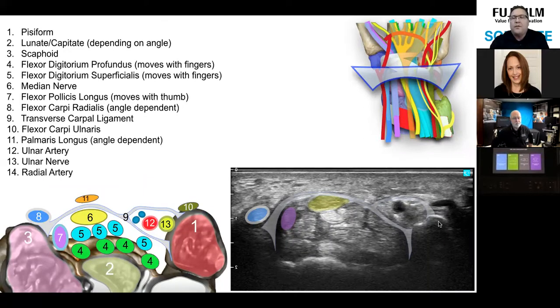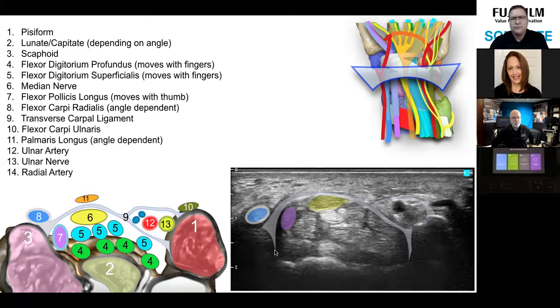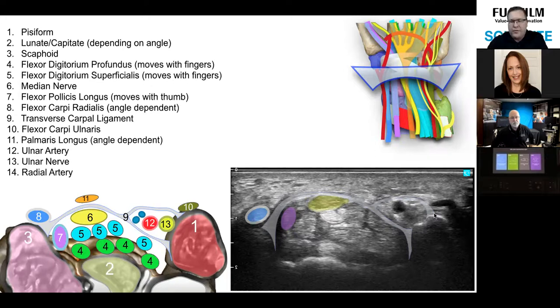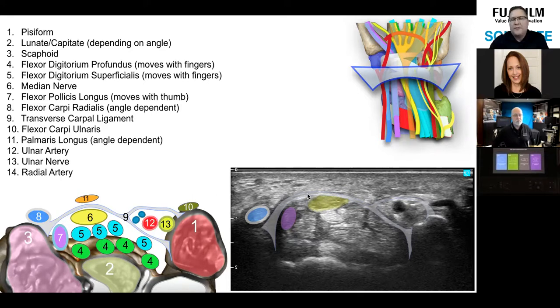On the radial side you'll see the scaphoid, on the ulnar side the pisiform. I always look for the pisiform first, then pivot the transducer radially until I see the scaphoid. This is a very angle-dependent structure. Here you can see the flexor retinaculum traveling down to the anterior margin of the pisiform and into Guyon's canal. The flexor retinaculum makes up the floor of Guyon's canal, comes up over the median nerve — there is normally no space between the flexor retinaculum and the median nerve.